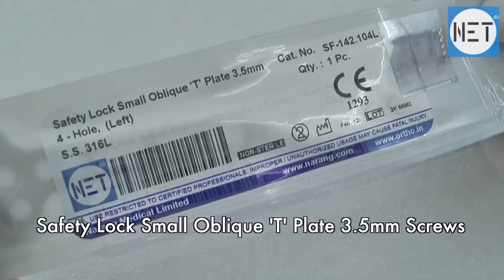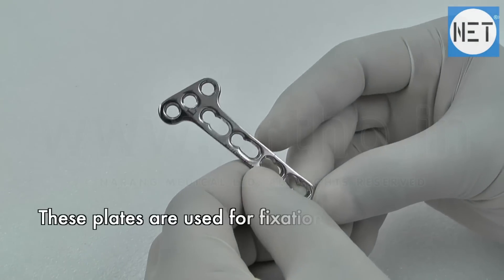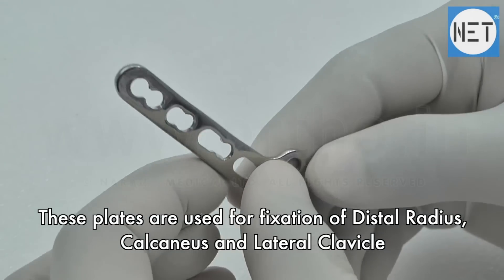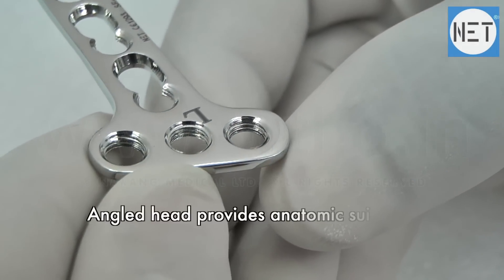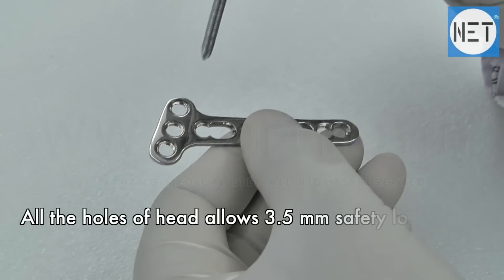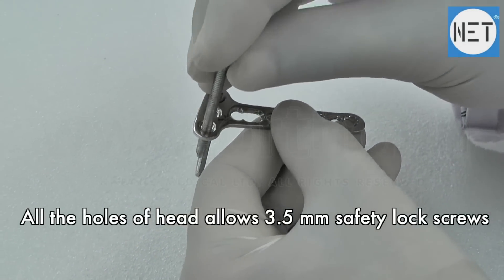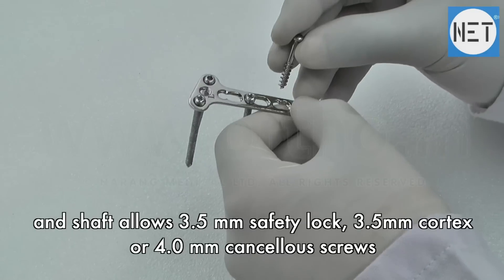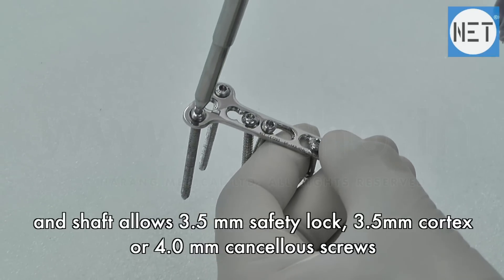Safety Lock Small Oblique T-Plate for 3.5mm screws. These plates are used for fixation of distal radius, calcaneus, and lateral clavicle. The angled head provides anatomic suitability. All holes of the head allow 3.5mm safety lock screws, and the shaft allows 3.5mm safety lock, 3.5mm cortex, or 4mm cancellous screws.